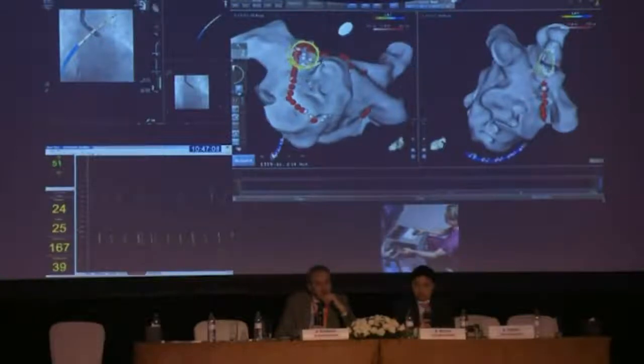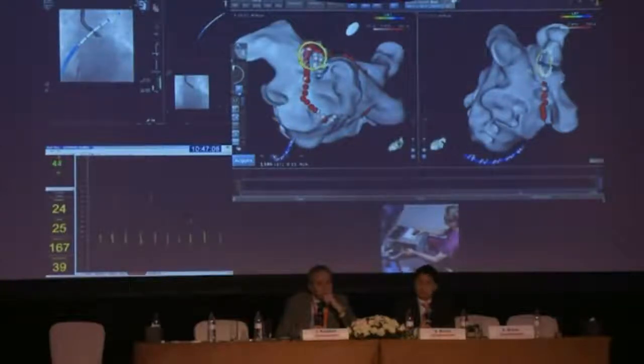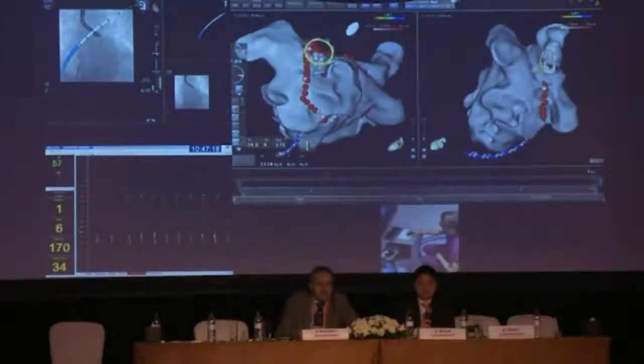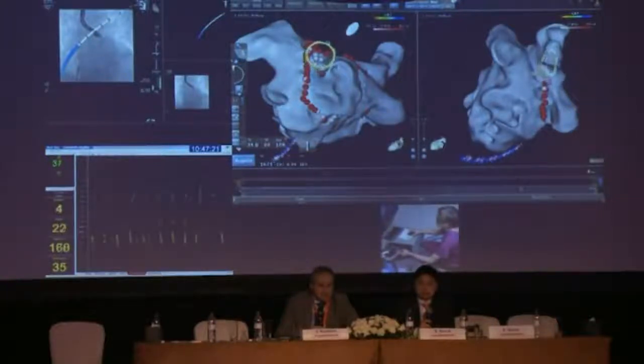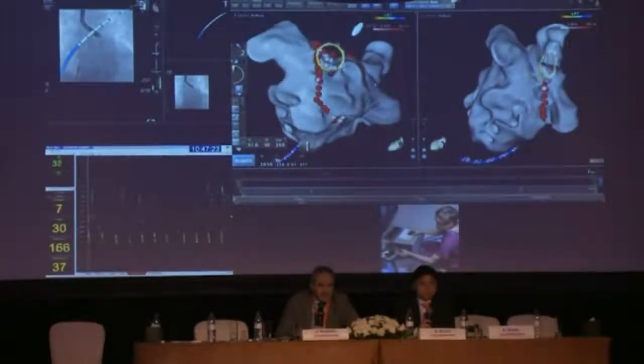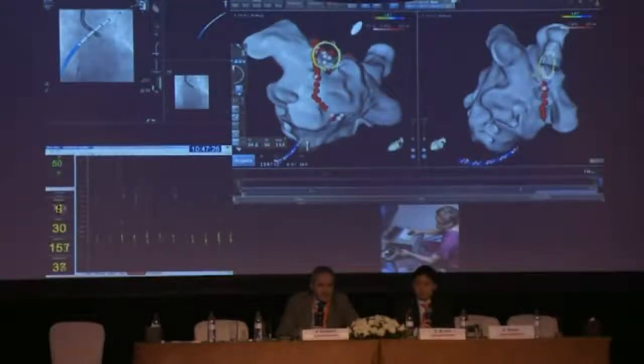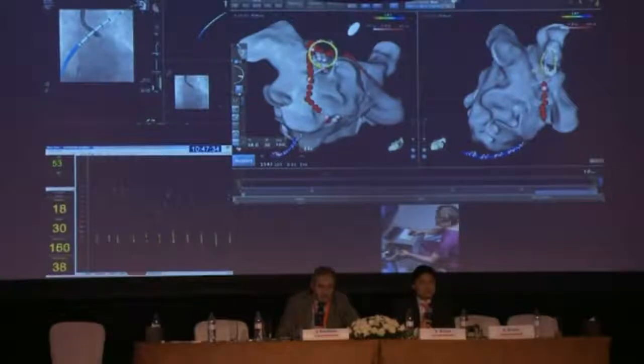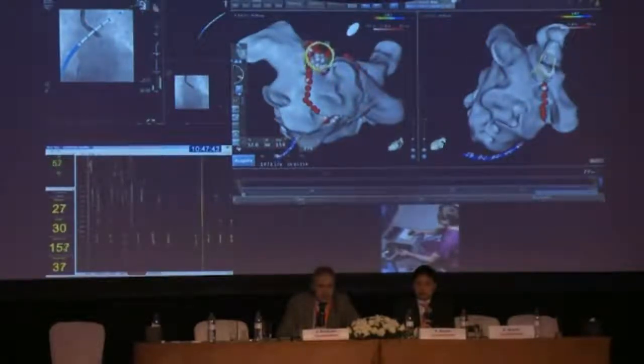If you did not have Smart Touch, then when we lost Smart Touch for a while because of the loss of the catheter manufacturing, we found that what we learned from Smart Touch actually meant that we could do pretty well without it, though we weren't as comfortable. We've also got the IntelliSense feature, which I don't think is as good as Smart Touch, but the Hansen force sensing does give you some feedback as to where you're sitting and the force you're applying. But the force isn't the only story. So for example, here you can see I'm on the venous side.